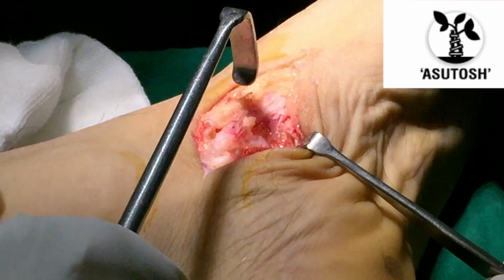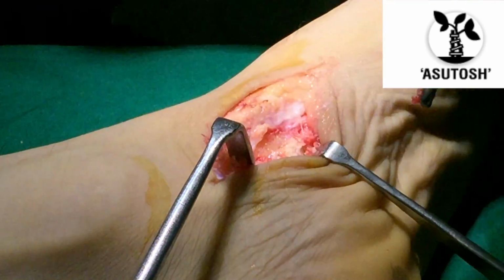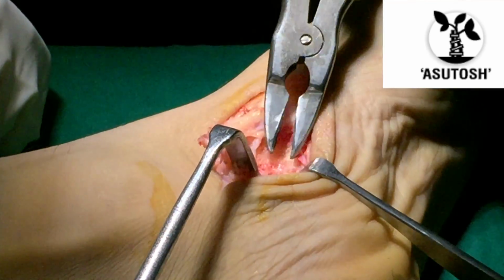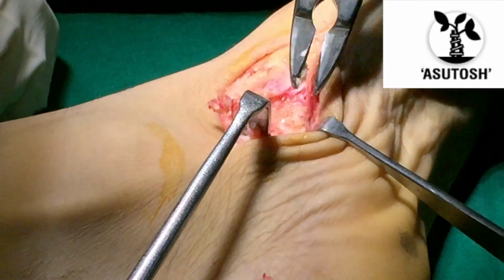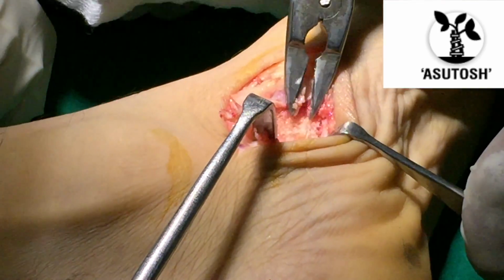So basically, with the removal of navicular, we have to make it into the level of the remainder of the foot. Right now we are removing it with the nibbler, bone pieces.